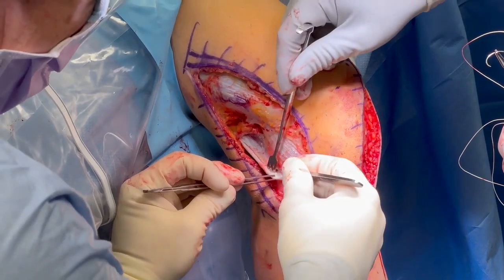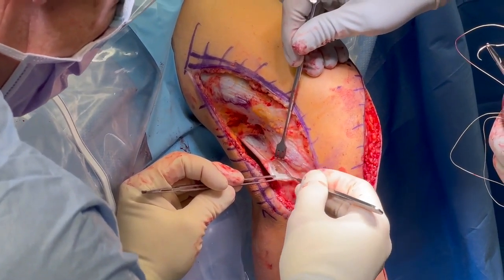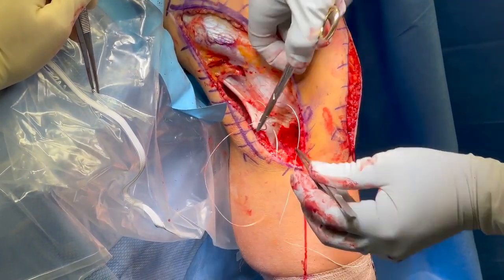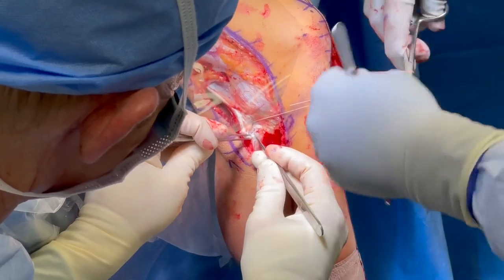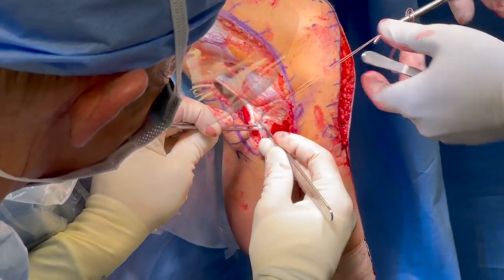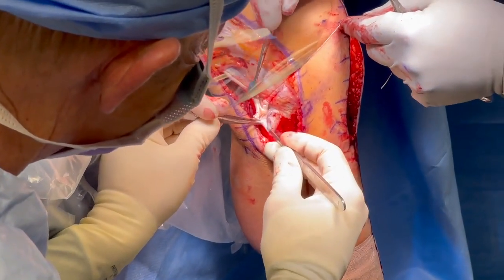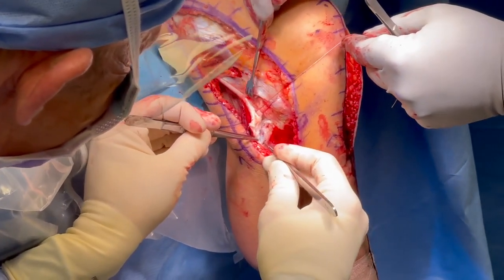The biceps bursa is entered to confirm the FCL is torn. A traction stitch is placed through the FCL to facilitate identification on the femur. The FCL attachment on the fibular head is identified and cleared off. This location is about 8 millimeters posterior to the anterior margin of the fibular head and about 28 millimeters distal to the fibular styloid tip.